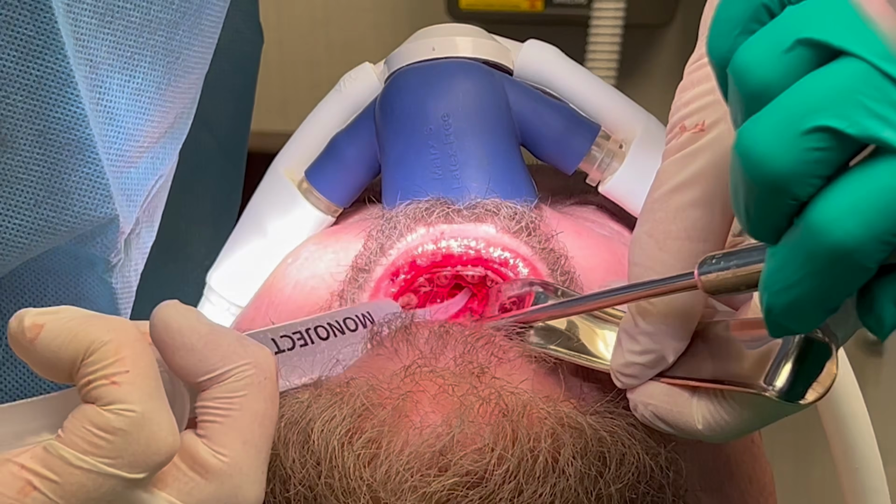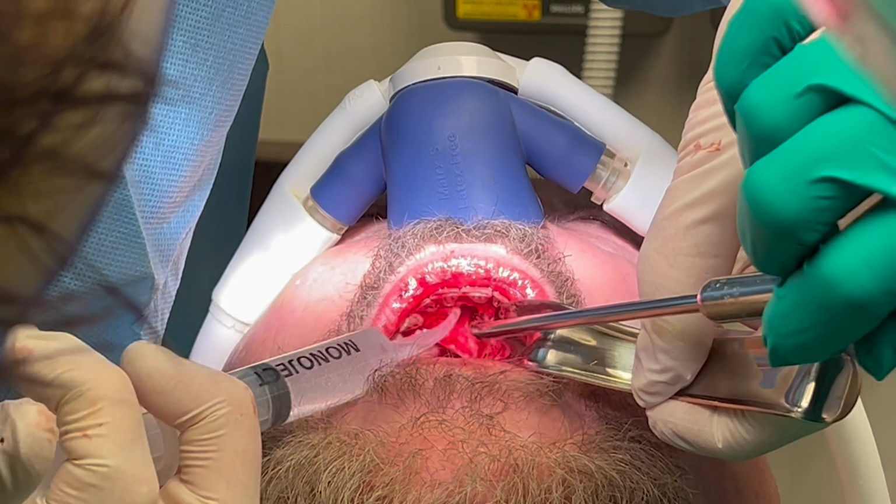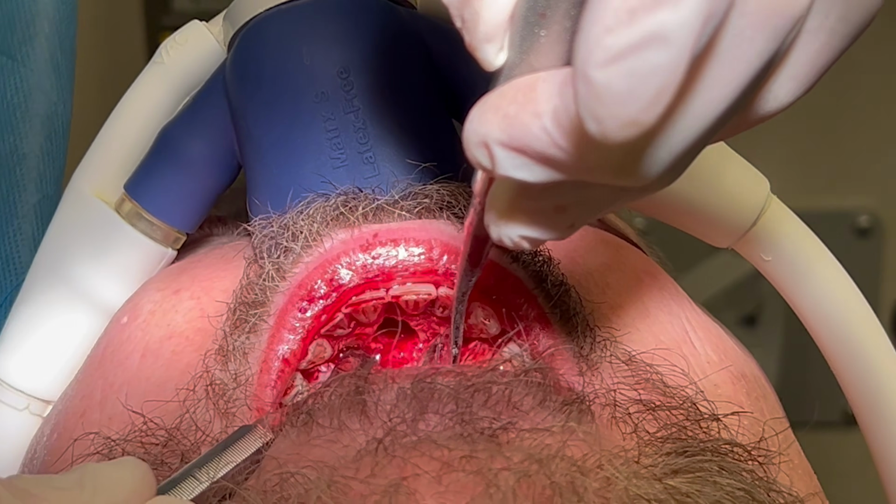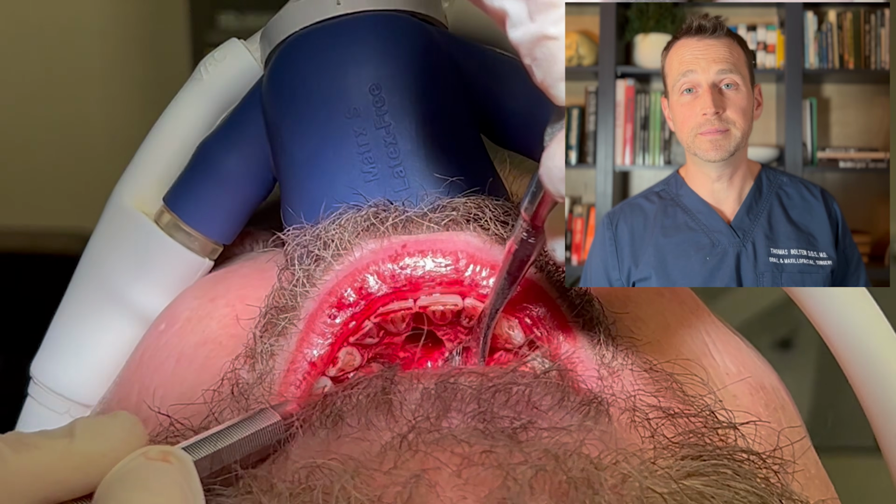Once I'm satisfied that I've removed this lesion in its entirety, I irrigate the area and confirm there's no bleeding. Here is the empty bone cavity. I then reapproximate the flap and close with interproximal sutures.